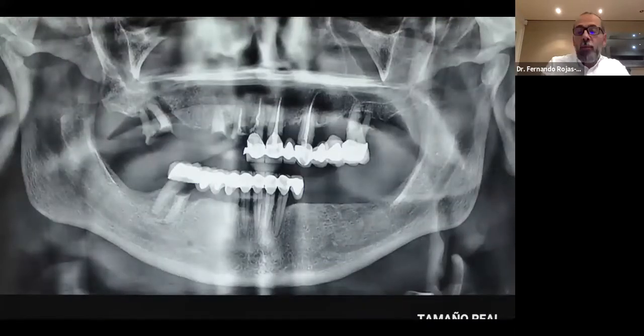As Homa told you, I was working as a surgeon at the beginning of my career, for like 10 years. And my philosophy was extract teeth and place implants where I have the bone. And then take impression and restore some of these cases. Other cases were for my brother, the dentist, or different clinics. A few were very nice in the aesthetic outcome, others very complicated to restore. Why? Because when I place implants, I just place the implant at the level of the bone. And maybe that bone is not ideal for the ideal teeth that we are planning. So we need to start planning the teeth.